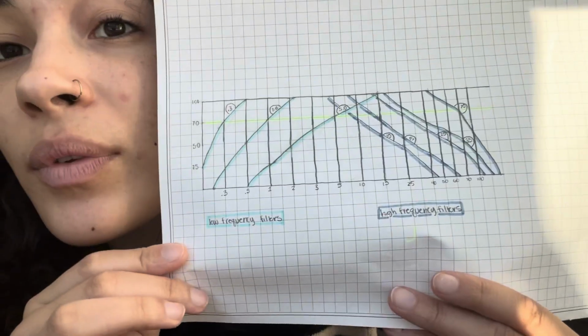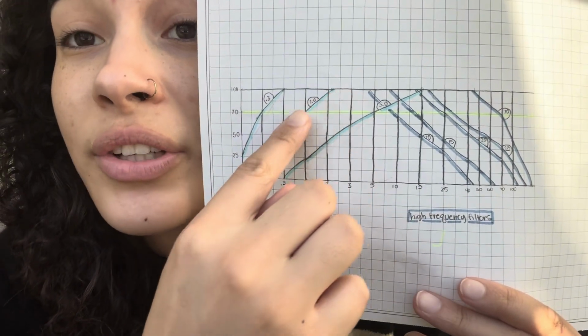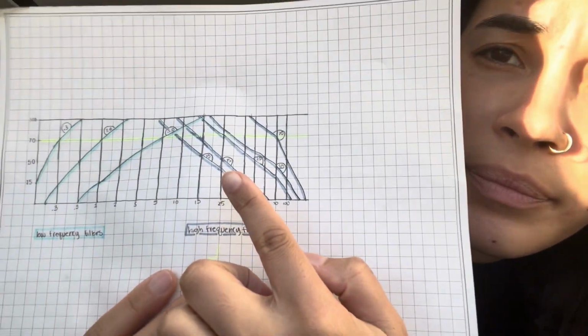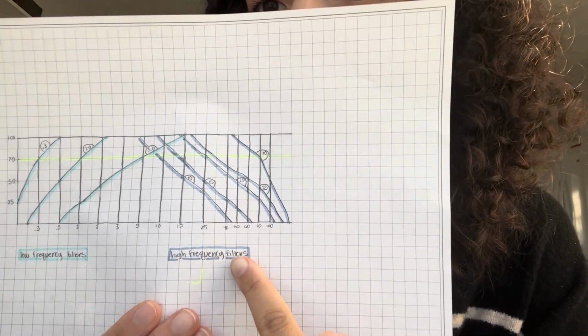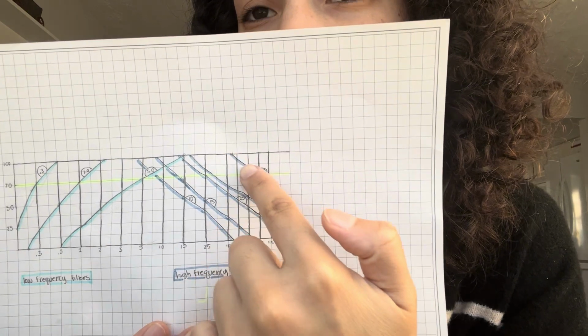On EEG, the standard filter setting is a low frequency filter of 1 hertz and a high frequency filter of 70 hertz. So our low frequency filters are these light blue ones over here. Our standard is this 1. And then our high frequency filters are the dark blue on this side, and our standard is 70. So that is over here.